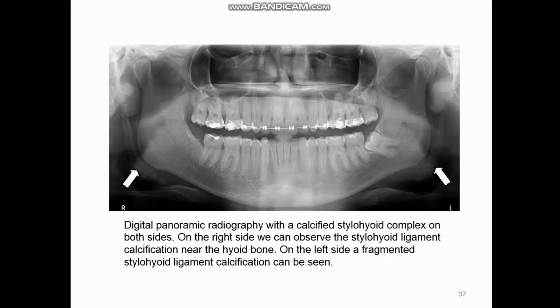plan to the patient. Also, the panoramic radiograph is an excellent imaging modality in patients with trauma, because such patients can't open their mouth and this is not needed to take a panoramic film. It's an excellent projection of diverse structures on a single film, which no other imaging system can achieve. Individual structures may be imaged by other methods once pathologic conditions have been detected using panoramic radiography.